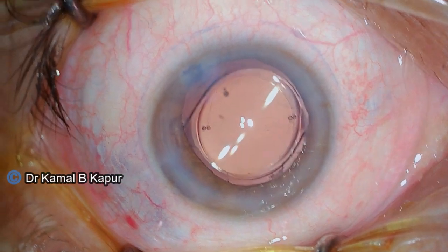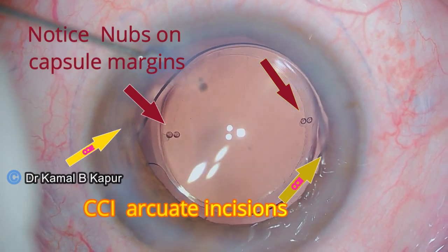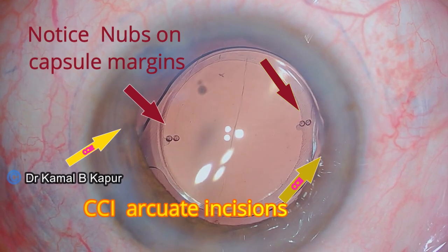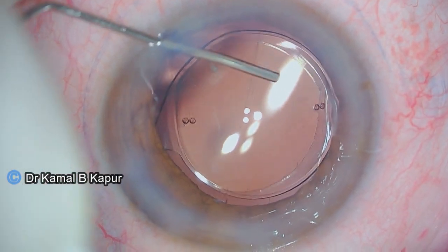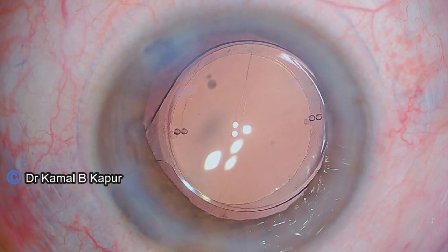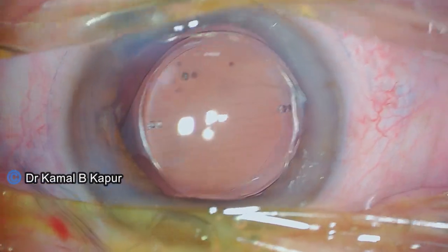Once the wounds are hydrated, we can now notice that the IntelliAxis is very much covering the toric marks of the IOL, and the corresponding clear corneal incisions used to compensate for the undercorrected toric IOL are in place. This patient has been doing very well post cataract surgery — more than six weeks out — maintaining perfect vision for distance at 20/20 or 6/6. This has proven that using CCIs as an adjunct to an underpowered toric IOL can be used effectively whenever required.